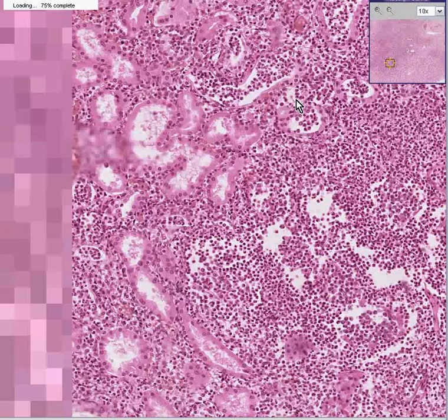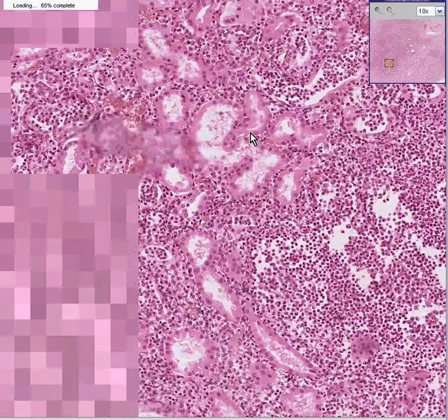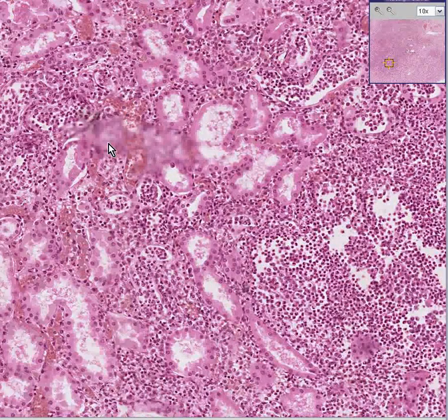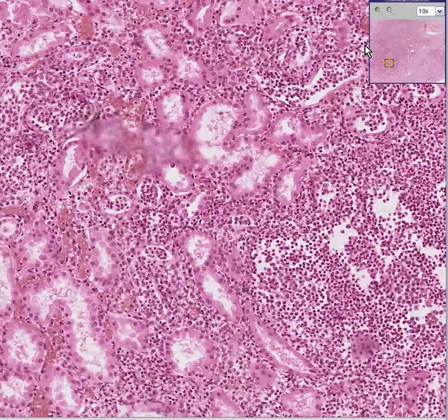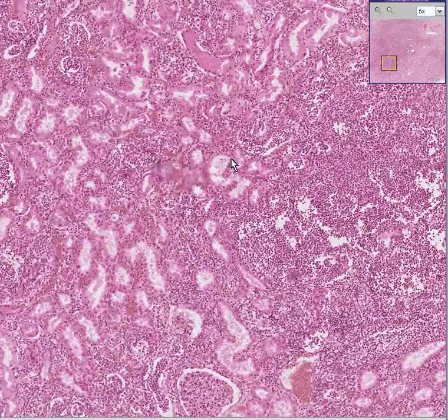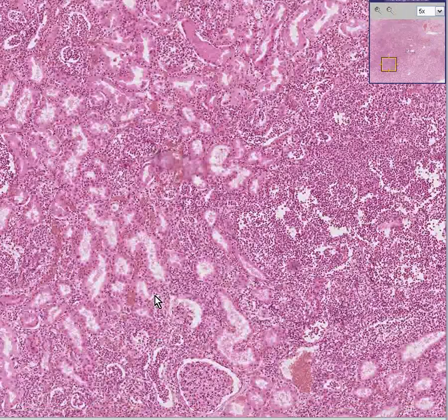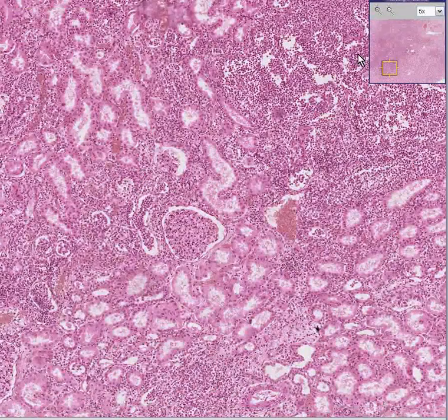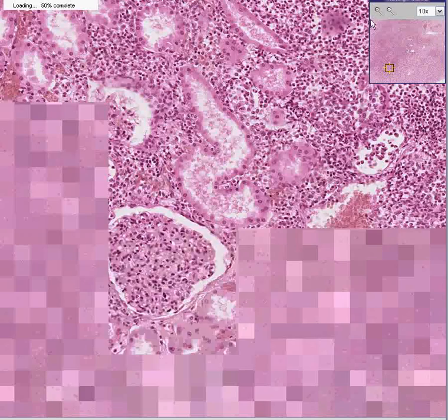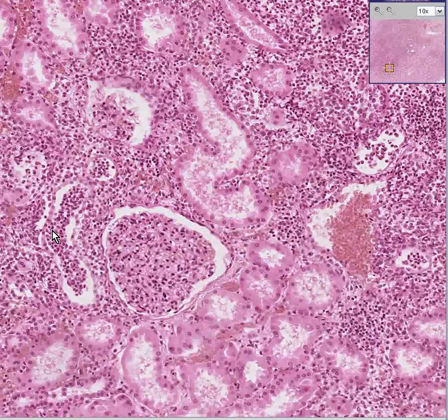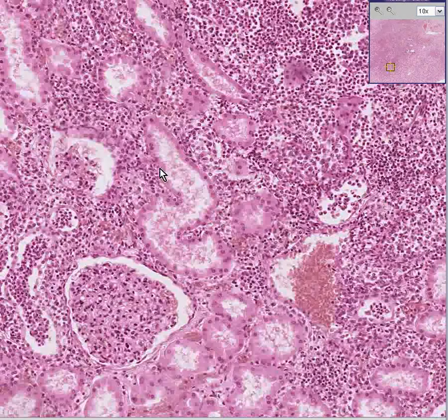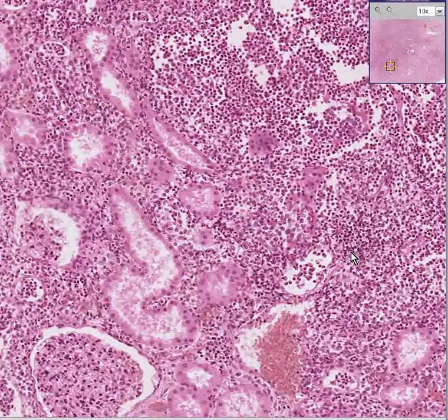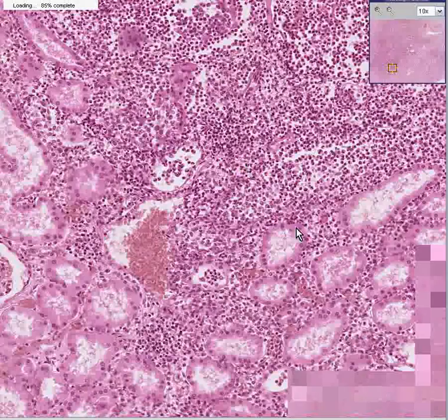Notice that in every area that you can see a glomerulus, they actually look pretty good. And let's go to one, like here. But notice that the primary process here is involving these tubules, like here.